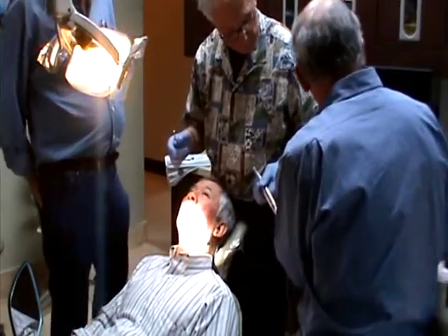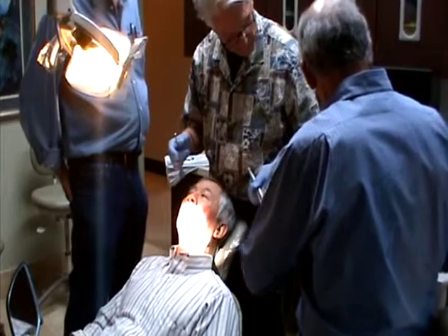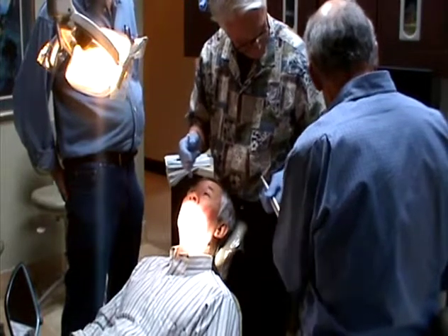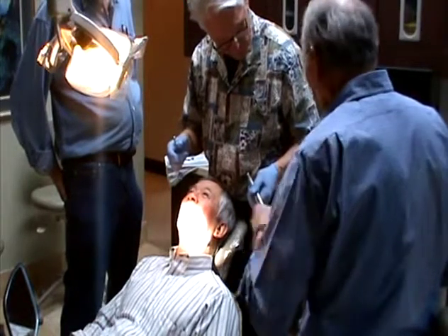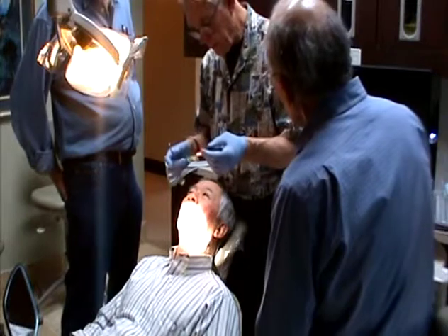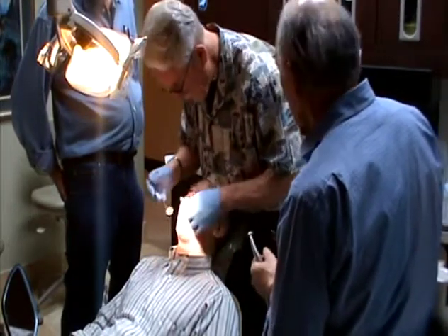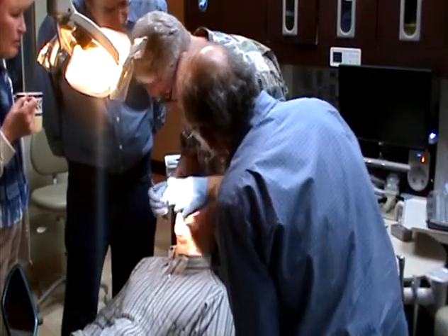Upper, lower tooth on one. The upper. You're going to jiggle me for a new bite record after this, because the previous one was good now, right? It'll be close, we haven't taken much, we've just taken half a thousandth off of it. Okay. The only thing you can see is the color coming off. It's that slight. I think it makes a slight difference.